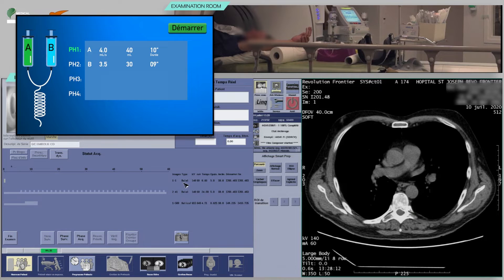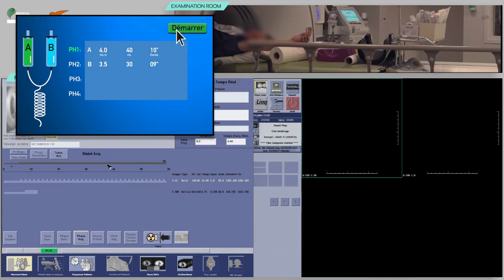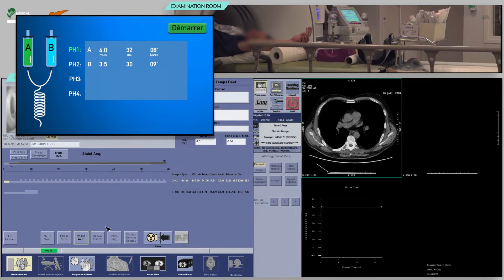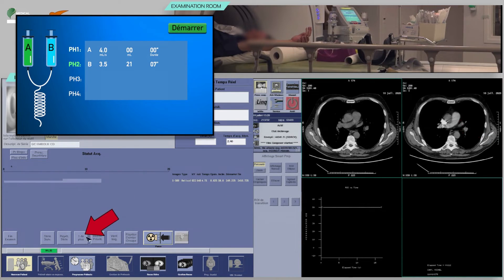Depending on the venous axis, it may be necessary to inject the patient with a high flow rate in order to obtain excellent enhancement of pulmonary arteries. Click on Monitor Phase. Start the injection and acquisition at the same time. If you have set a region of interest, the scan will start automatically as soon as the selected enhancement threshold is reached. Otherwise, click on Acquisition Phase to start the scan at the desired time.